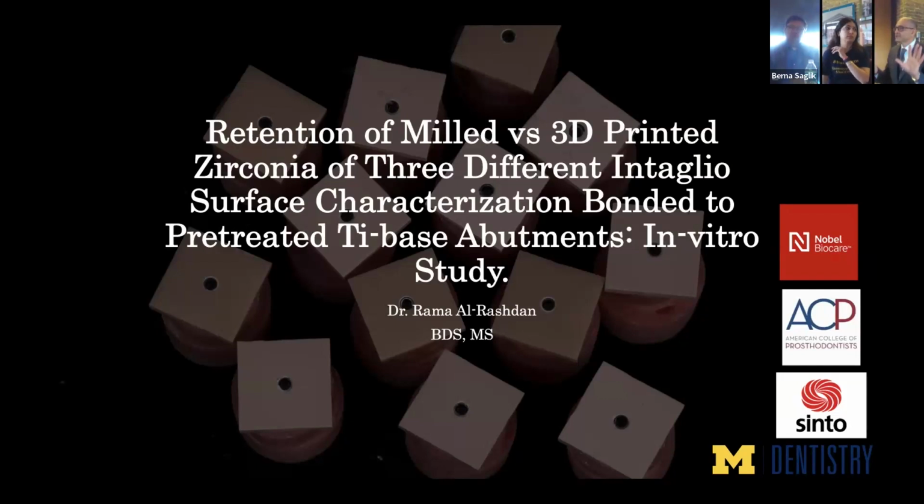The ceramic printing is completely different, and those printers may not be compatible with the ceramic, and also the post-process is very different. You don't have that much post-process. You take it out, cut the supporting bars, take the excess resin out, cure it, and it's ready to go to the market. However, the ceramic one is very, very different because you have to do two firings: debinding takes all the resin out, and then crystallization. So completely two different printers, two different concepts.